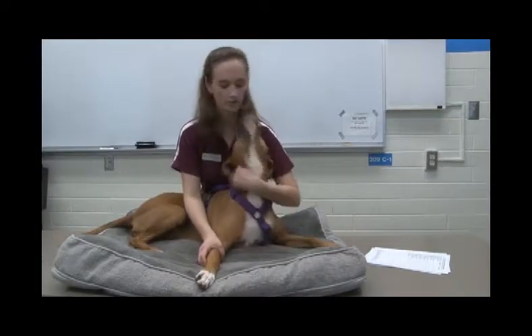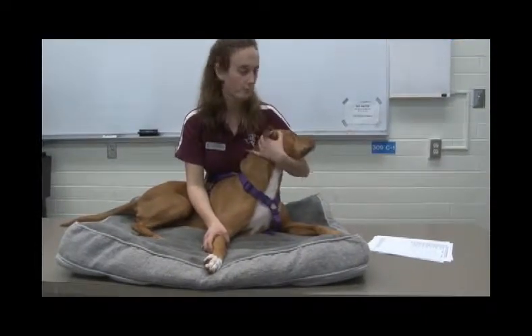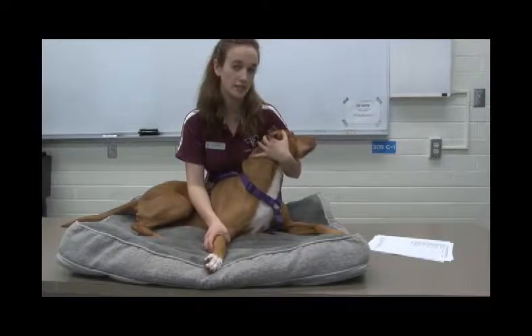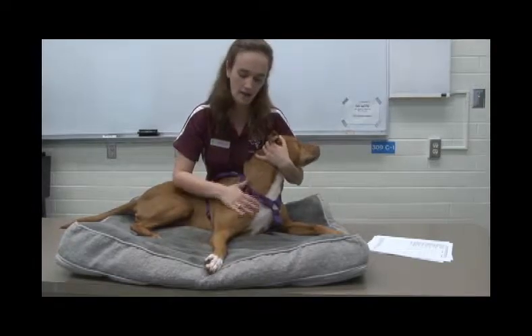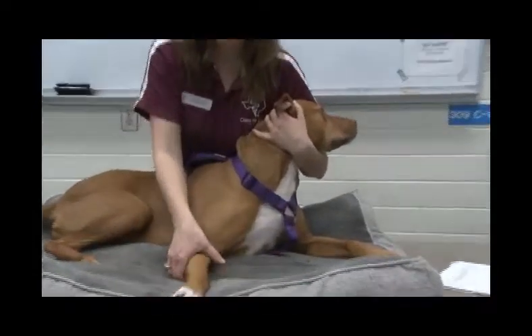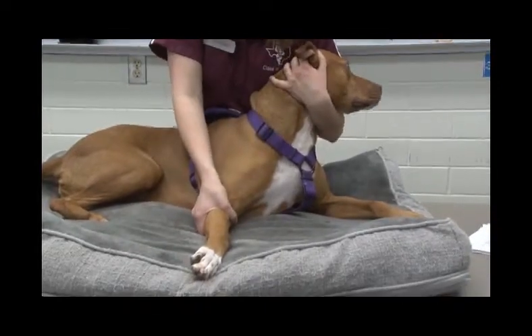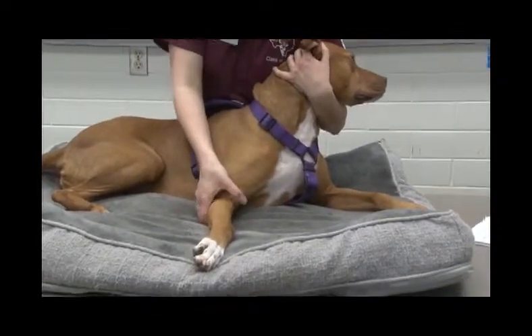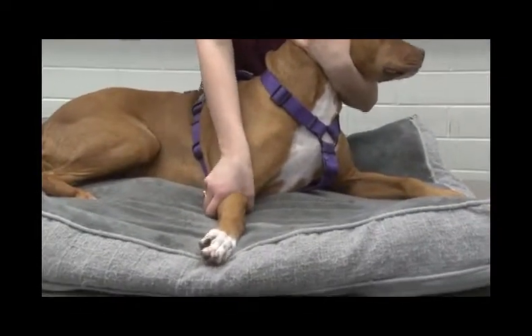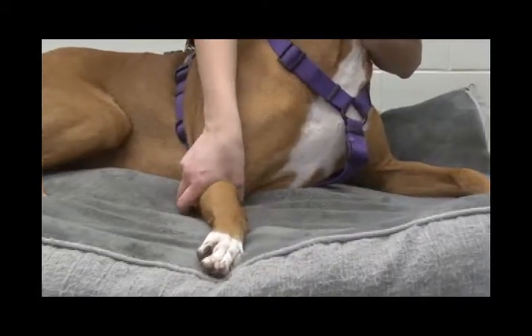You're going to grab the animal close to yourself and point the mouth away from you, so if she did bite it's not straight at my face. You're going to reach over the animal, put your hand on the elbow, putting your thumb on the medial — that's the inside of the leg.